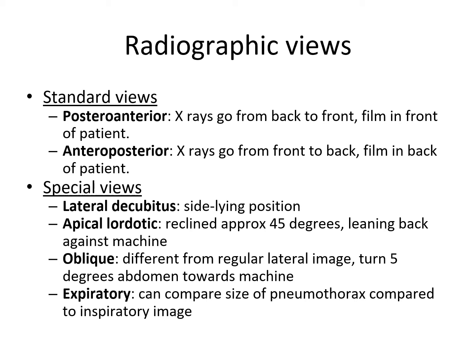They do a lot of AP views when a patient's in bed, like in ICU. After they've had an ET tube placed, x-ray will come up. We try to get the patient sitting upright in the bed, bringing the head of the bed up so they're sitting as much as they possibly can, not quite at a 90-degree angle.